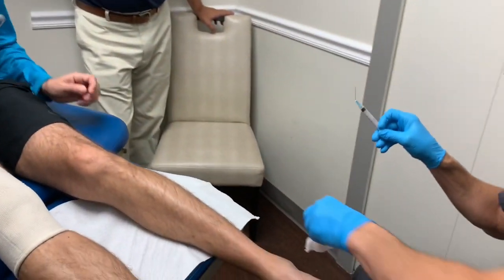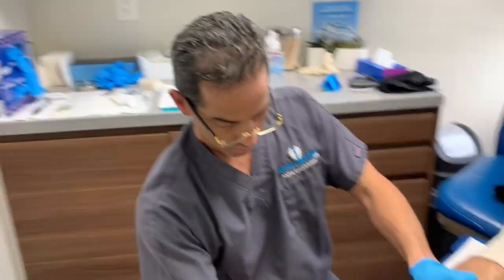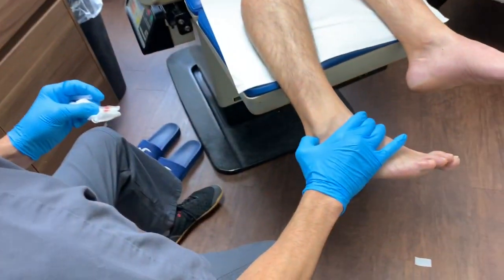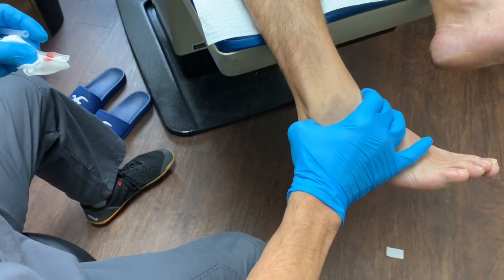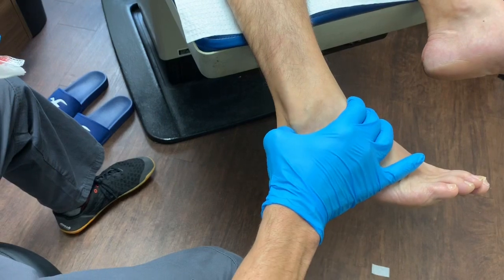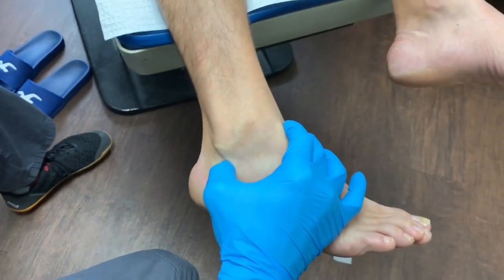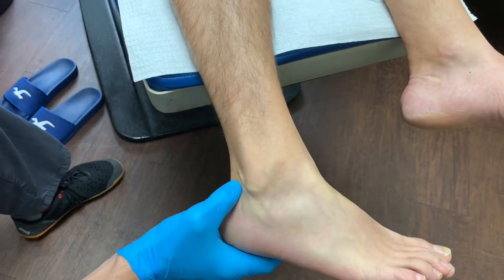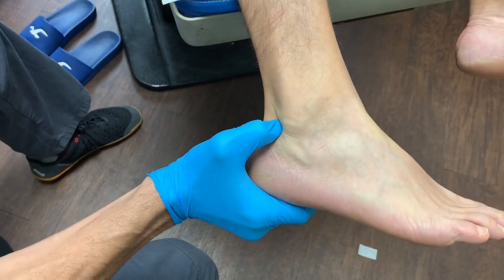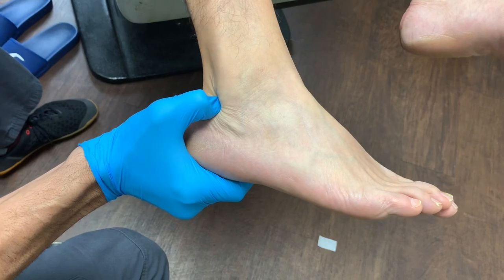Now there's no anesthesia on the right side. Come around here. I already know where his discomfort is — it's around here, right here. Let's check here. What about here? Yeah, right there, right there.